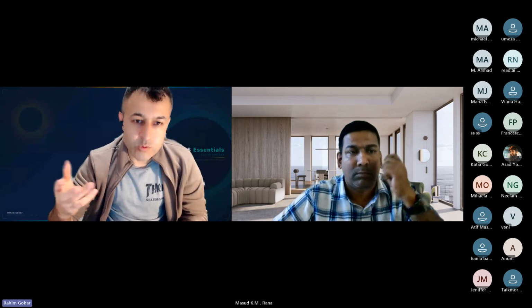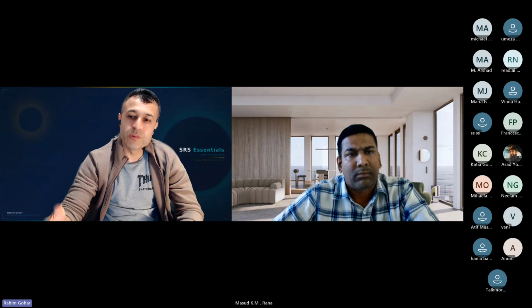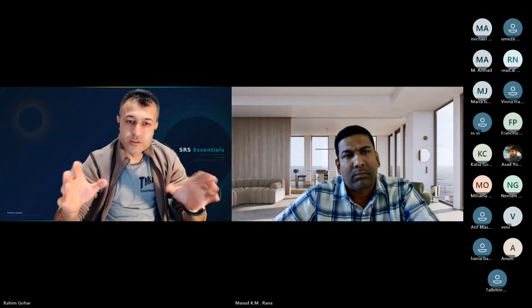Once they are happy, then they will create a QCL. You know the QCL in Mosaic, right? For physics, we do the patient-specific QA. Once we do the patient-specific QA, we create another QCL for our RTs so that they can prepare. On the day of the treatment, there must be a physicist on site, there must be an RT on site. Then you can treat the patient. So within a week, this should happen.